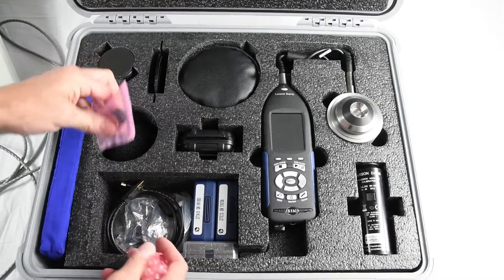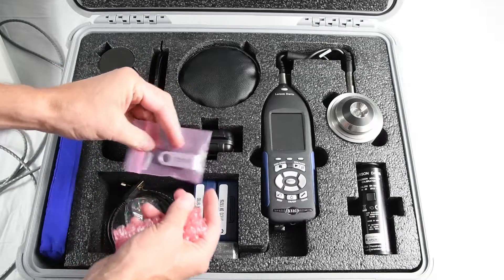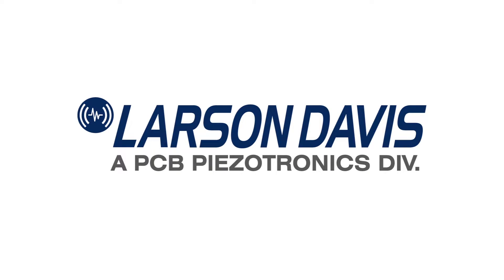And finally, a USB storage device that contains the G4 OddCal PC software and the reference manual, where you can find all the information needed to get you started on your next audiometer calibration.